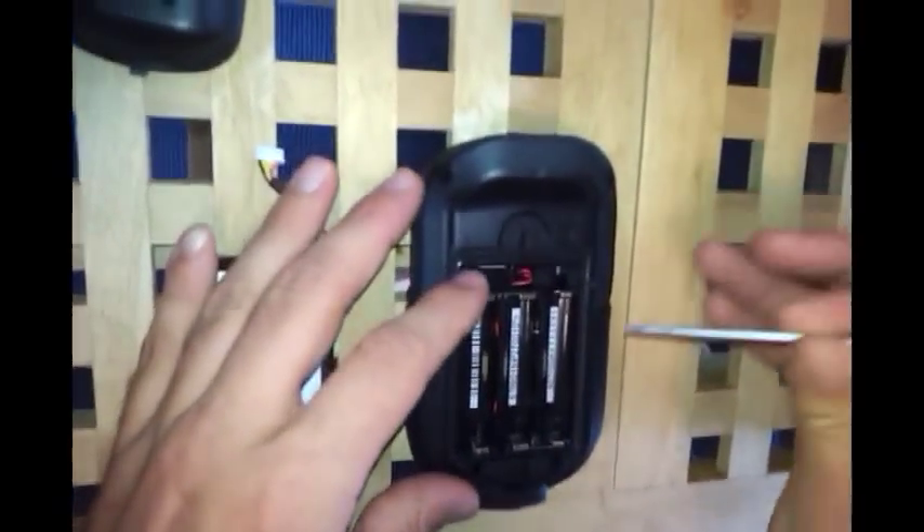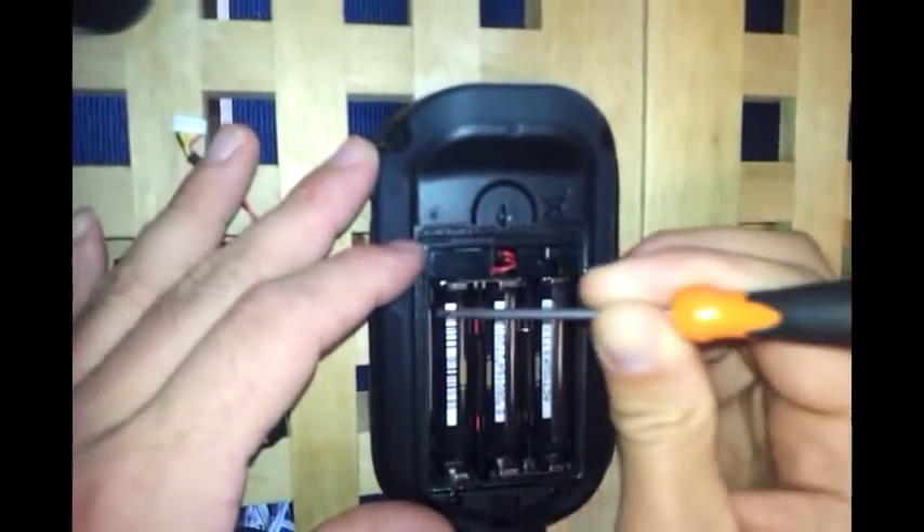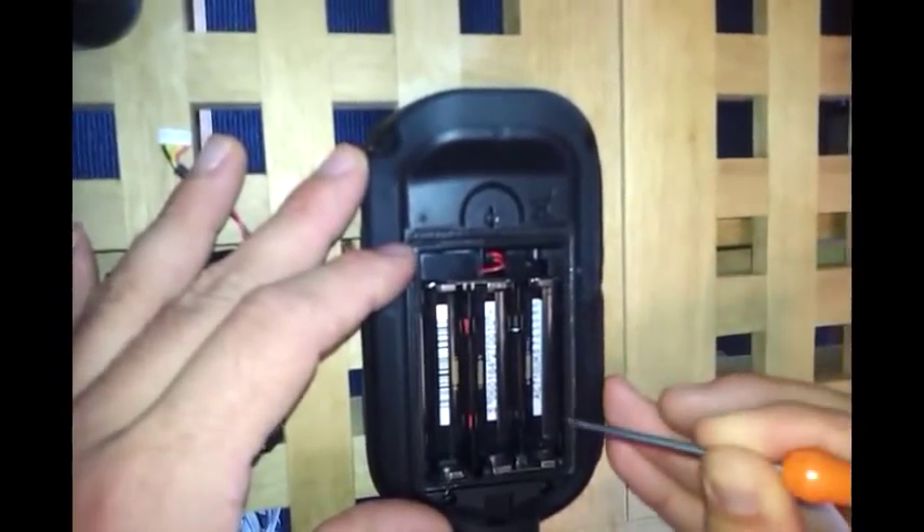Then what you'll need to do is insert the flat-headed screwdriver into the two clips on the side of the device. They're on both sides and either side will do — you just need to push it in the gap and lever that away.